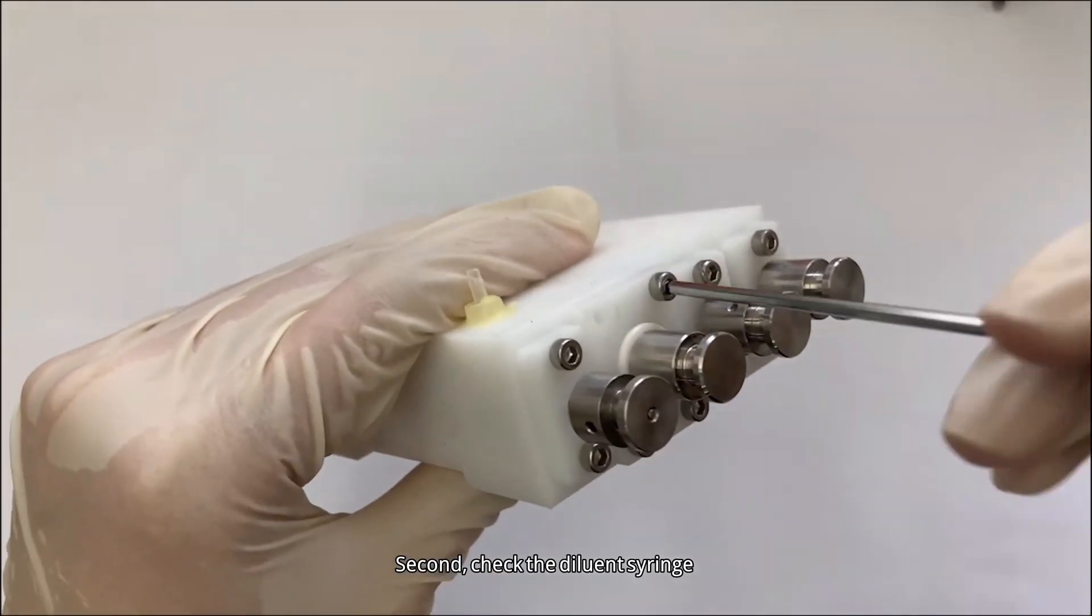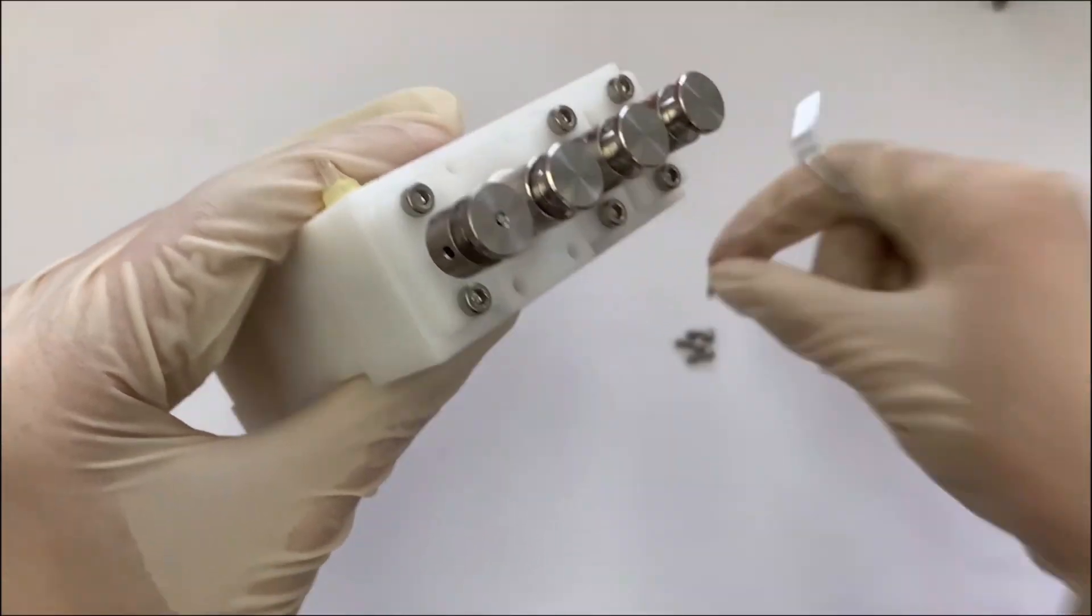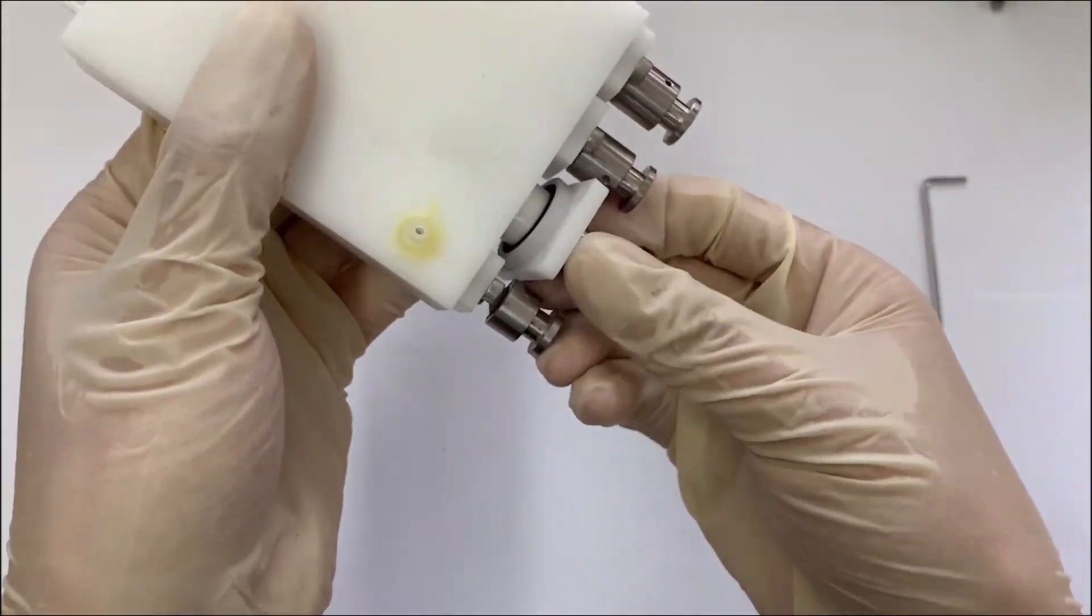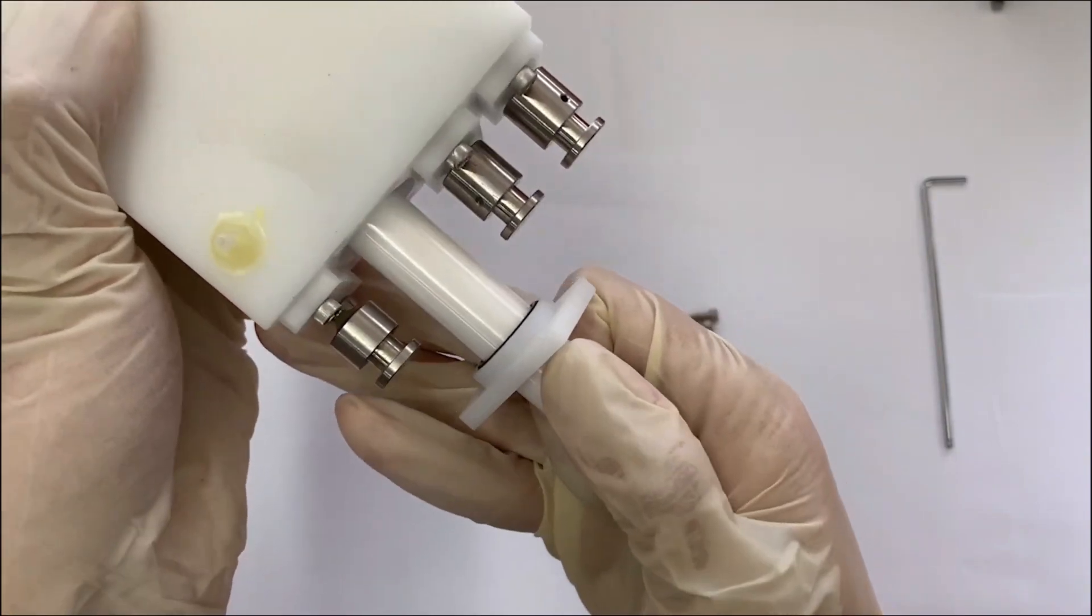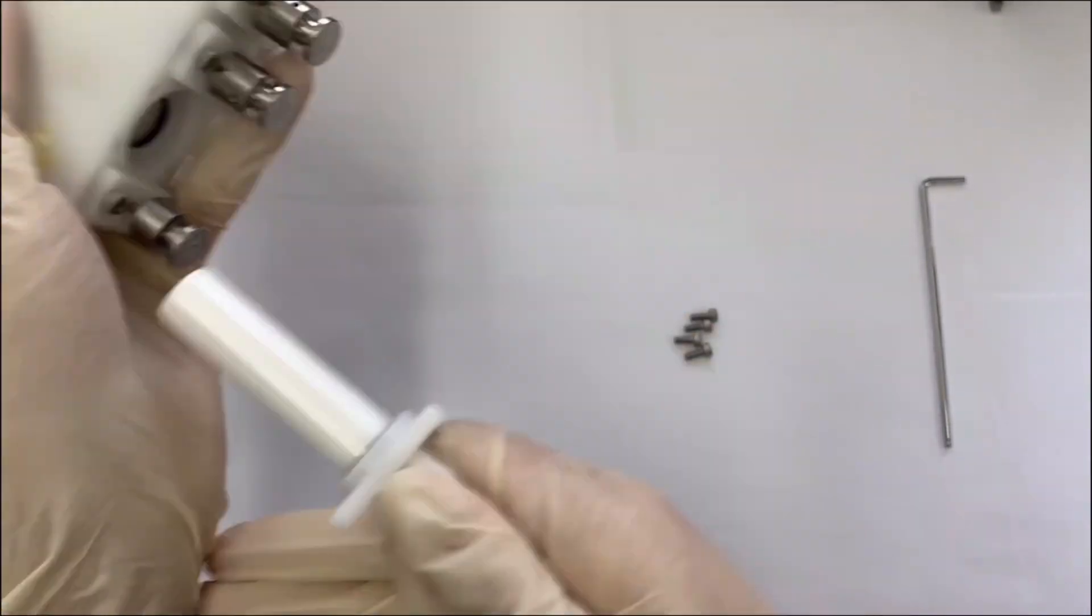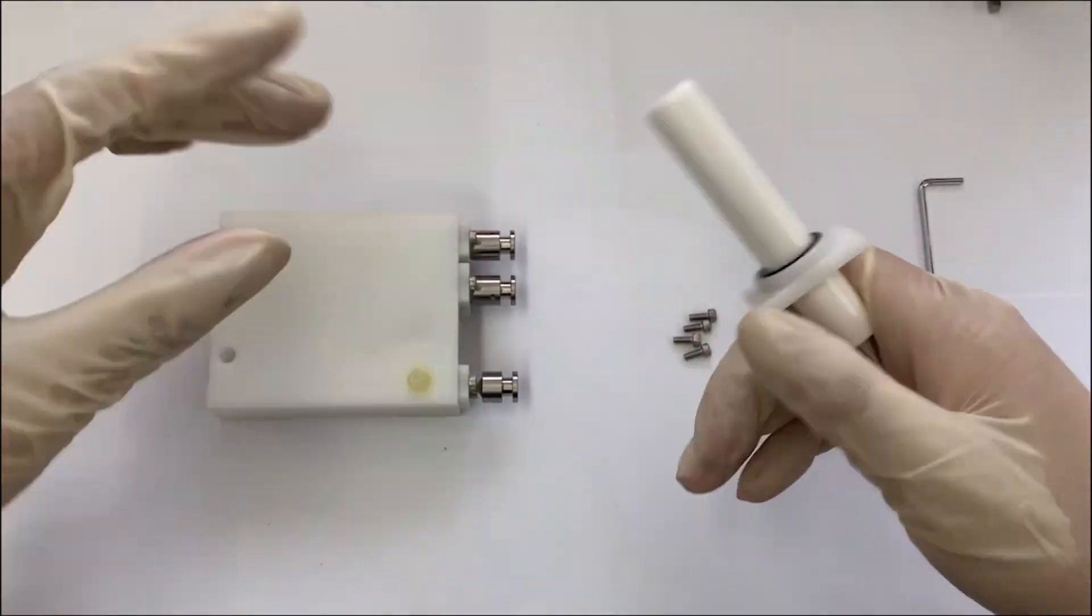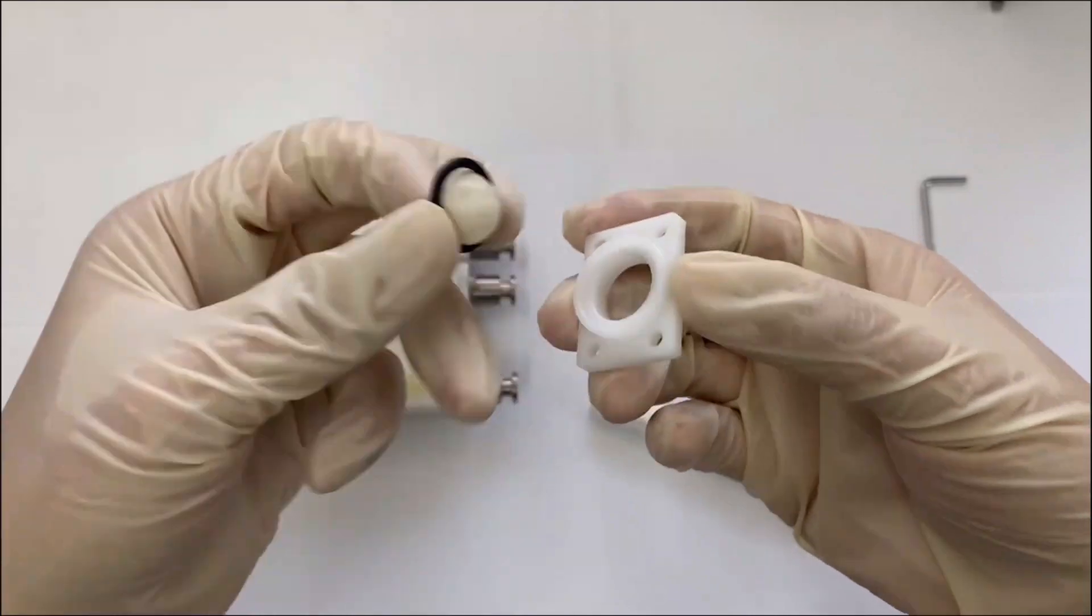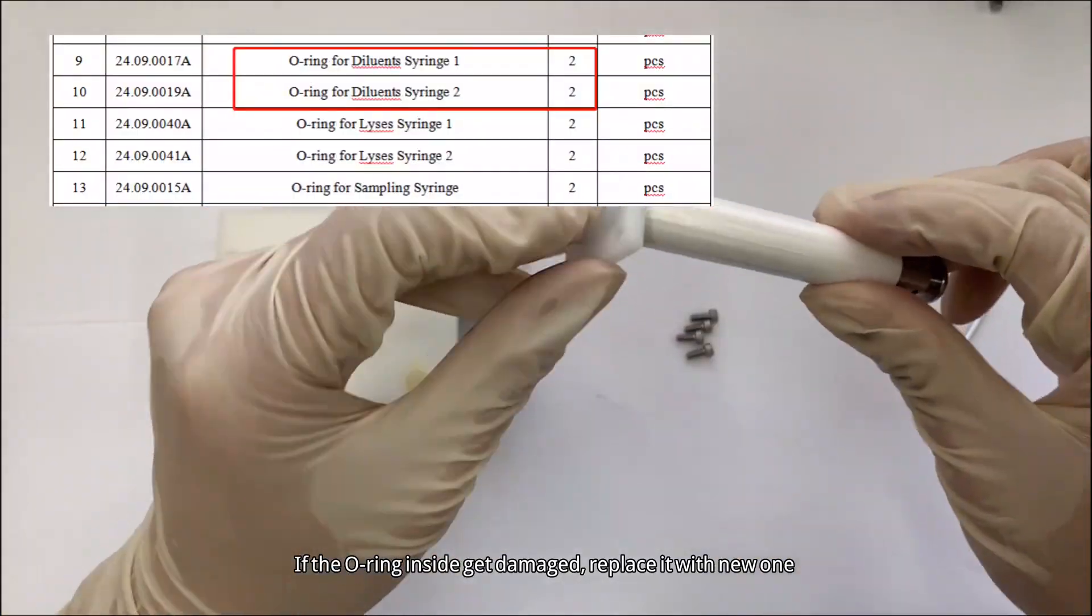Second, check the diluent syringe. If the O-ring inside gets damaged, replace it with a new one.